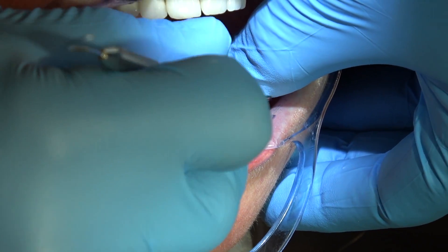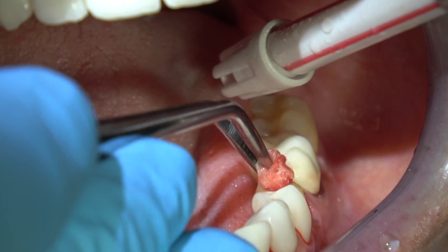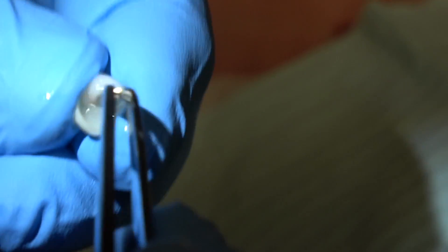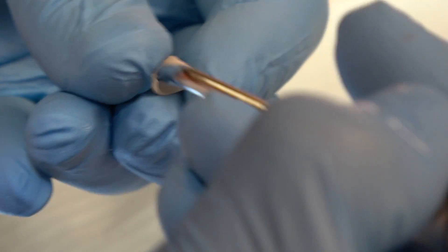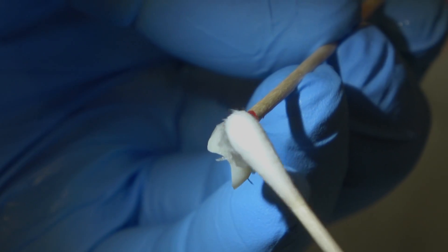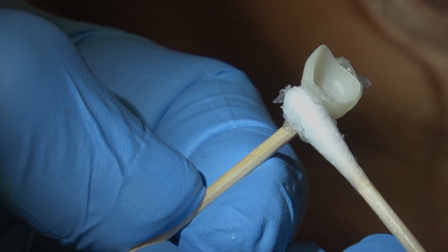I'm checking the margins with my explorer, wiping the tooth with tubulicid acid. Before we try the crowns in, we've pumiced them with a prophy cup and pumice and water. Then we've placed two-by-twos in the mouth and wiped the teeth with isopropyl alcohol and rinsed that off. We're cleaning these crowns that have been treated either with sandblaster or with Z-Prime, depending on what the material is. We're drying them out real well.